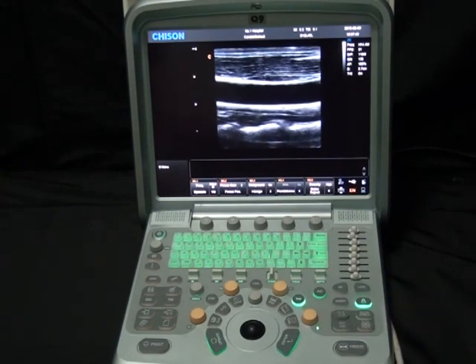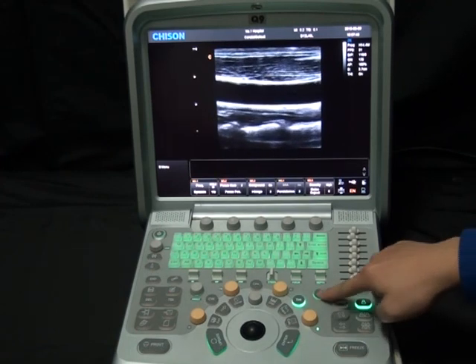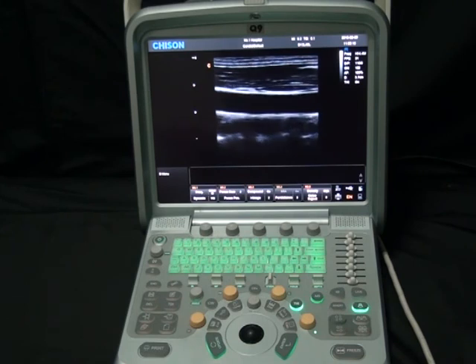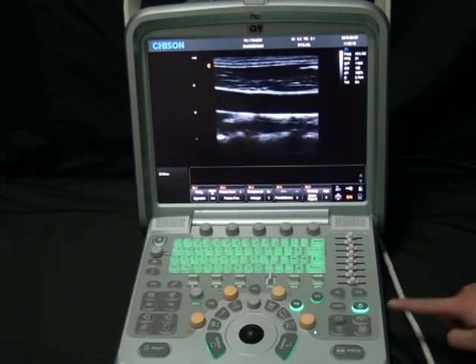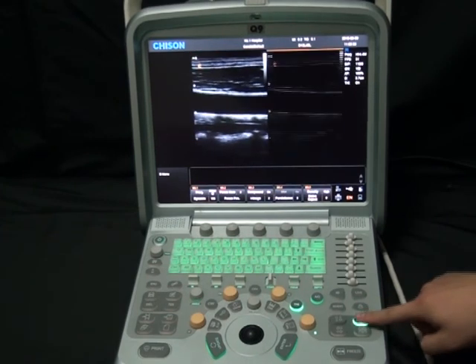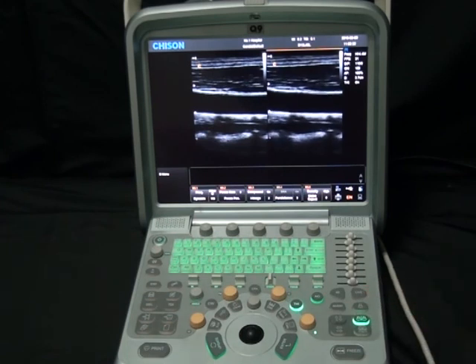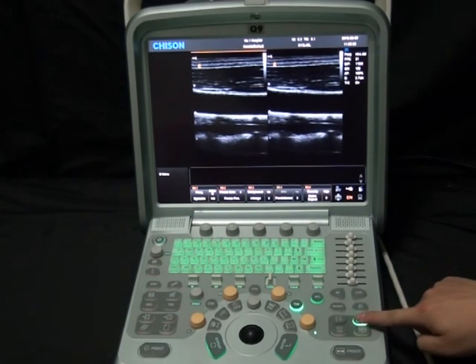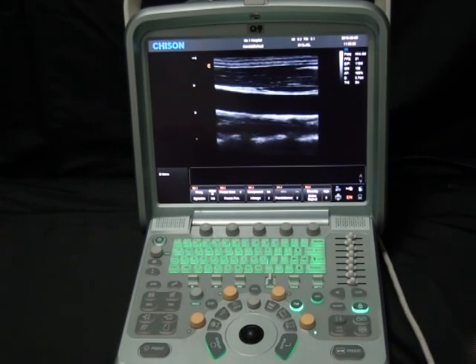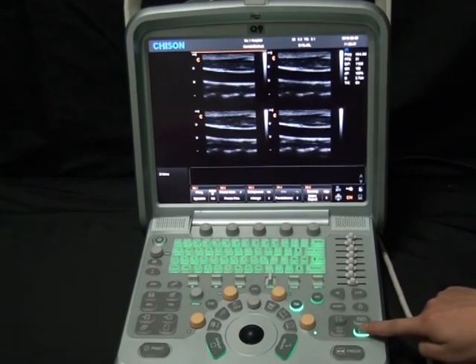What's more, as I mentioned before, one key to optimize the image is available. Press AIO. With just one key, the quality of the image can be in a suitable status. What is worth mentioning is that we have 2B mode and 4B mode. For example, 2B mode. With dual screen, click for the first and get one active. Push it again and the next becomes active. Back and forth allows you to switch between those. Push the single key to go back to the single B mode. The same works for the quad screen.